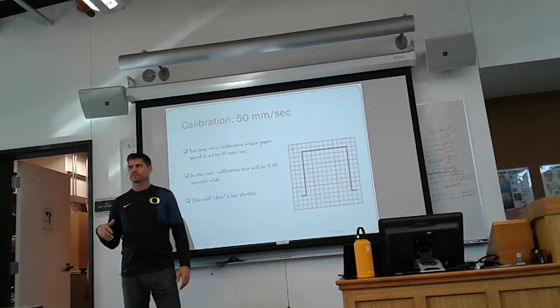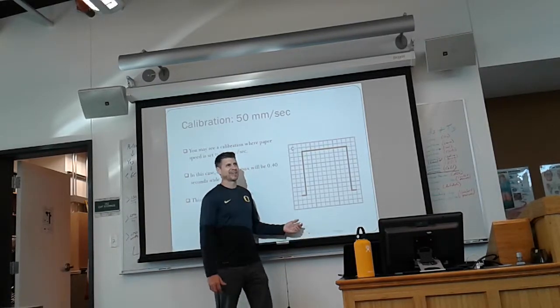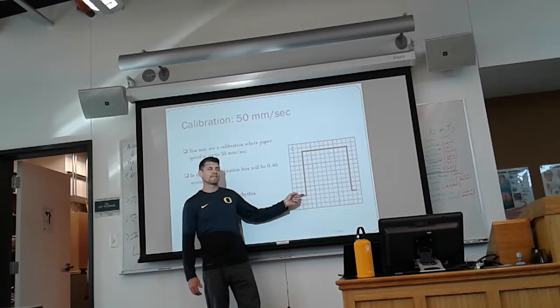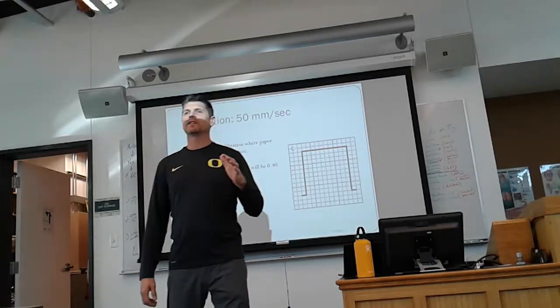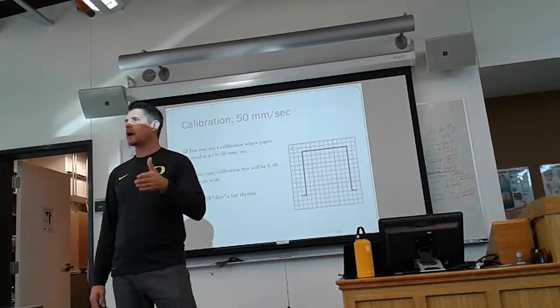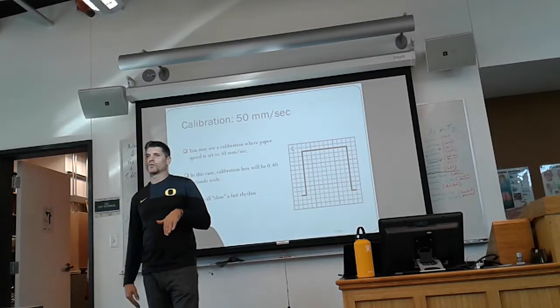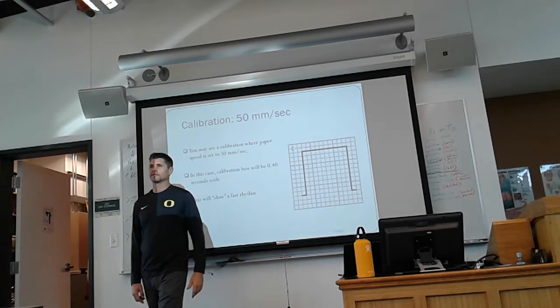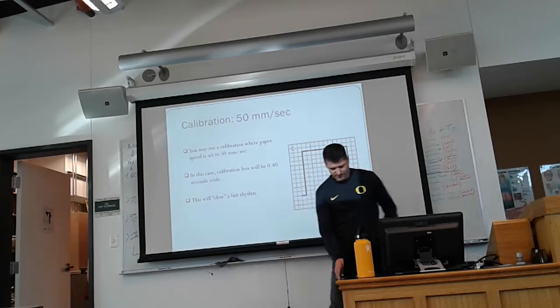Good? Fantastic. Questions on that? In this case, the amplitude is not changed. So any of the criteria that we're doing for hypertrophy or any of the criteria that's related to how much electrical activity is happening amplitude-wise is fine for us to measure, but we'd have to make an adjustment to the rate, right? Because the rate would actually be twice as fast as whatever our measurement tells us it is. Does that make sense? All right. There you go.